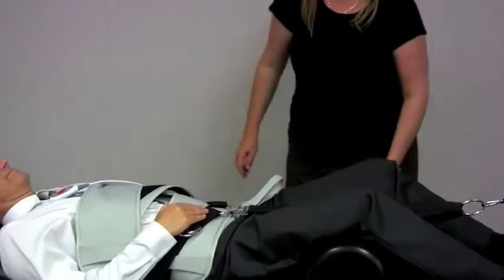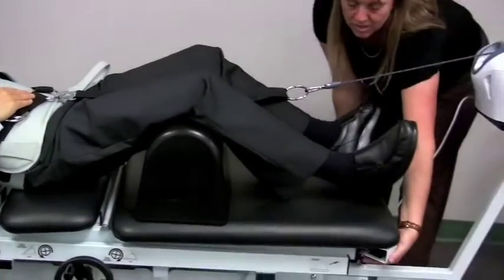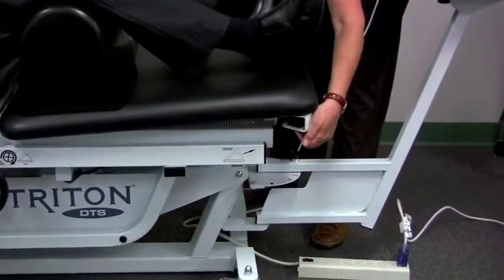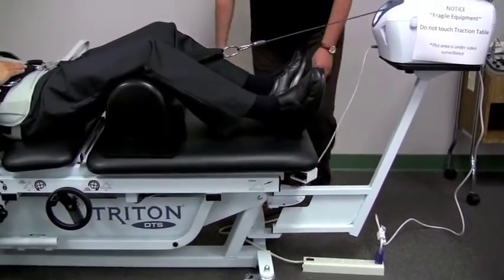All right, now you're down only to 16 pounds, and the table is getting closer and closer together as we're going. And one of the things I didn't really mess around with, but I could have, and since he's on low pounds, I could do this just to demonstrate this. There is a way to lift up this piece of the pelvic piece so his legs are up higher or lower. Okay, so you can change these different angles for all sorts of reasons.